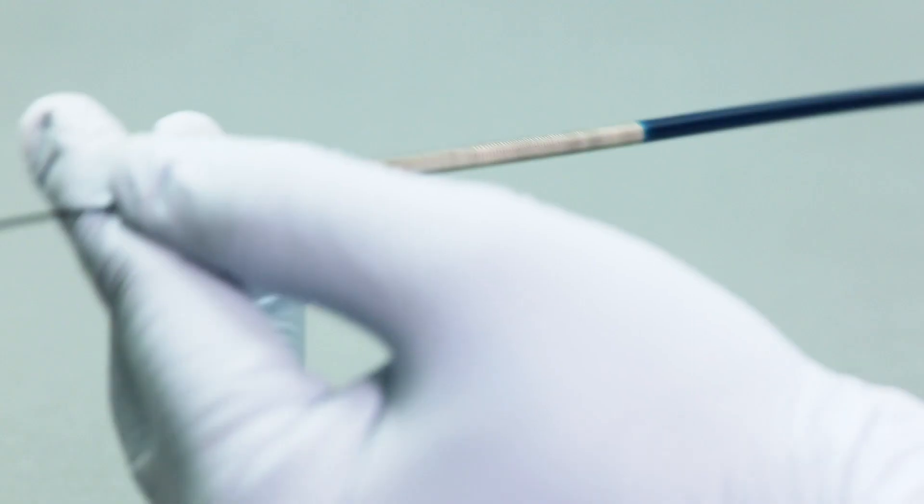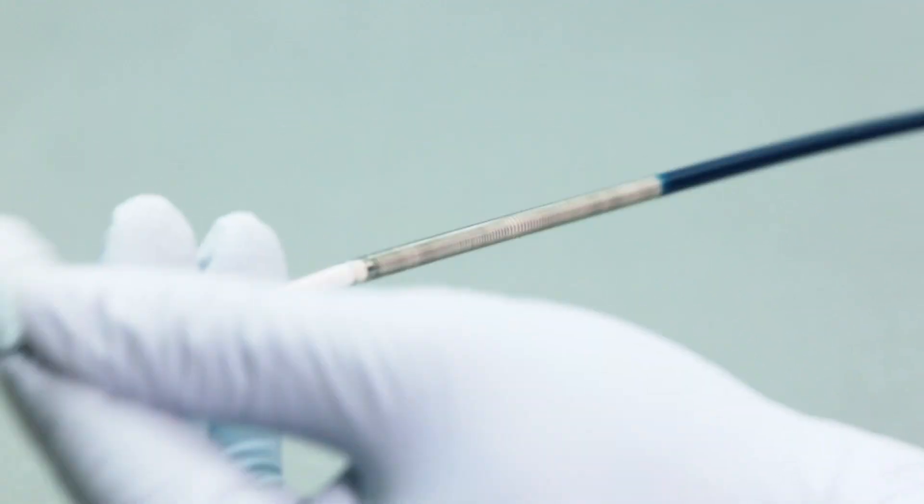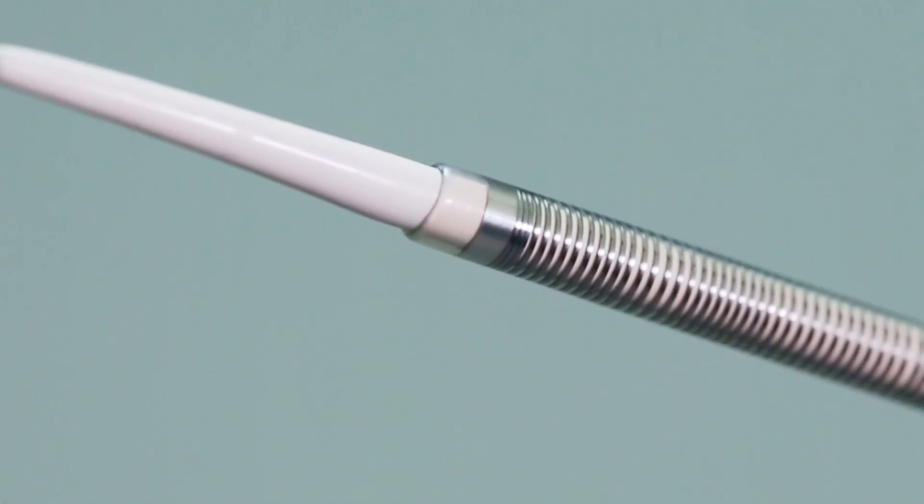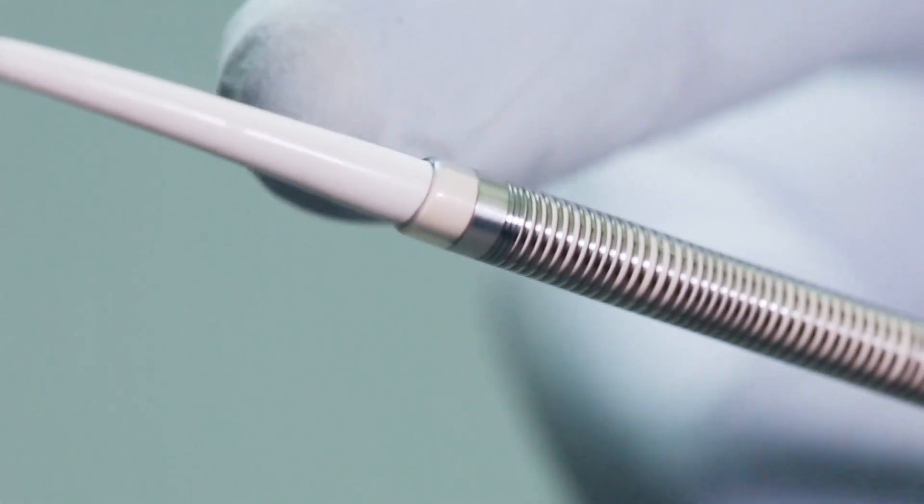The platinum marker band aids identification of the sheath's tip under fluoroscopic guidance. A contrast medium can be injected if required.